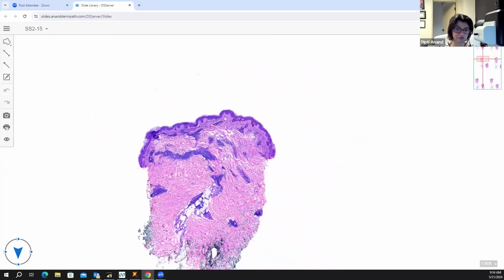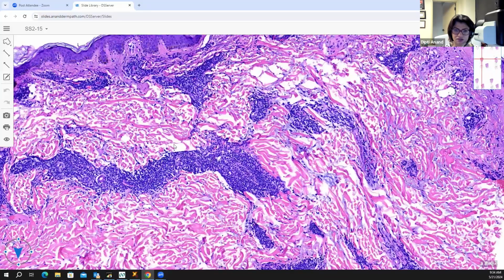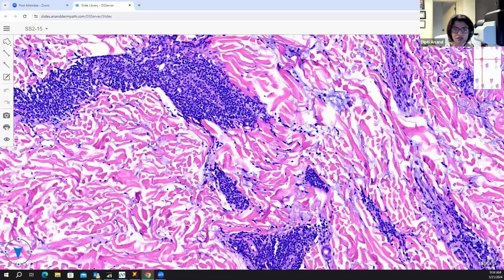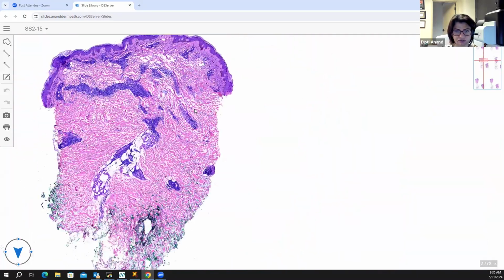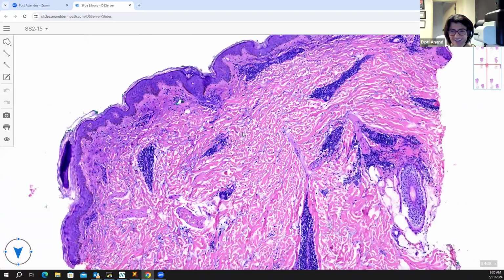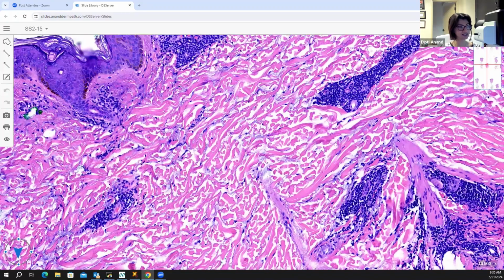Tight perivascular cuffing. Here, the epidermis is completely uninvolved. Tumid lupus, the epidermis is uninvolved, and you can actually see mucin. So the only way to distinguish between EAC and tumid lupus would be to look for the presence of mucin. For this entity, it's important.